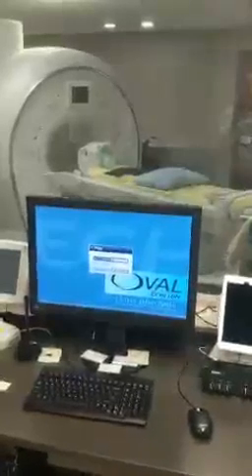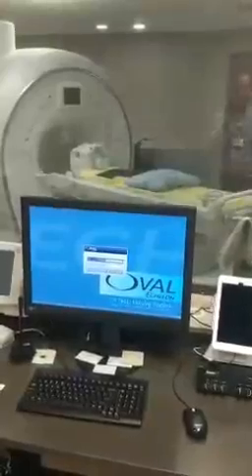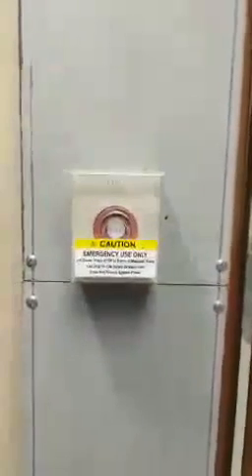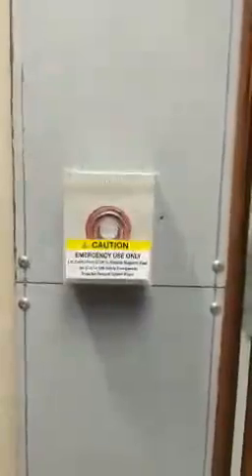This is an MRI tutorial of the two emergency safety buttons located in the MRI unit. On the wall next to the door is the MRI quench button. This is only to be used in life-threatening emergencies, such as having a patient or a staff member being pinned against the scanner by a large metallic object like a wheelchair or a cart.